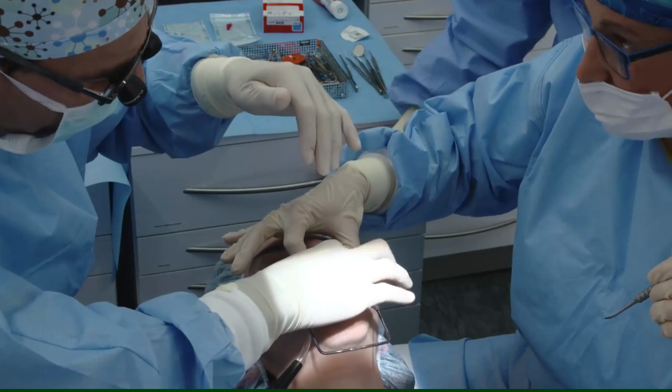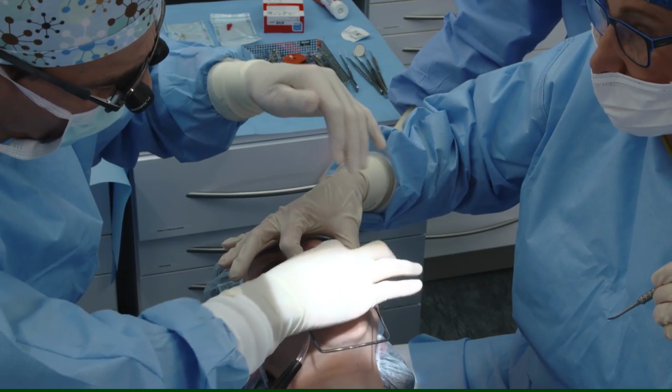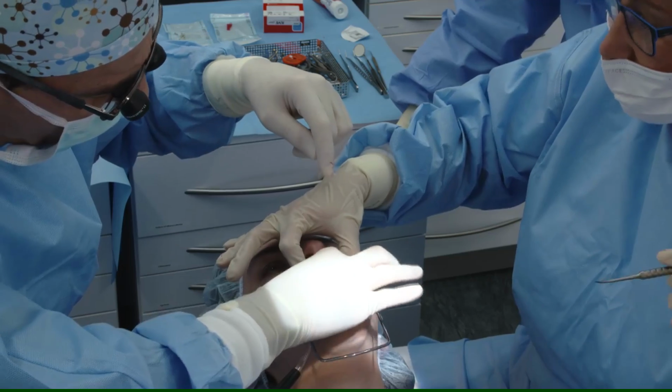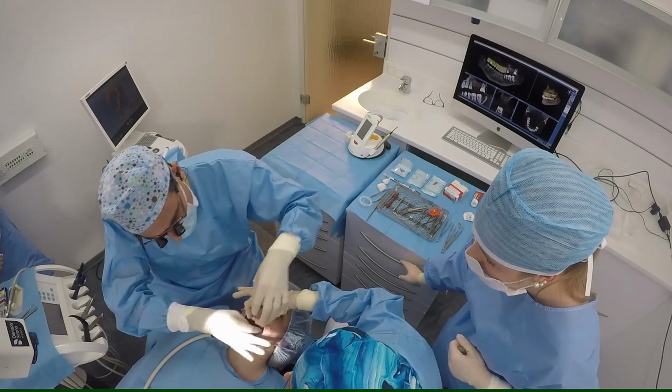It's a double blister system, a shuttle. And now we can use the implant driver. You can do it either manually, like you see it here, or you can also use a contra-angled handpiece with or without torque control. It's up to you.